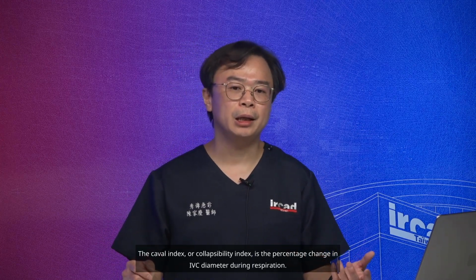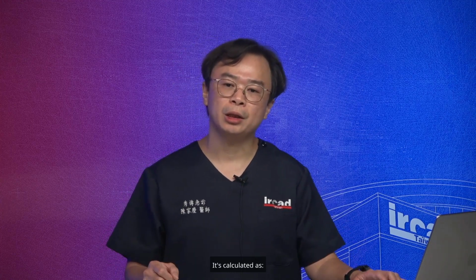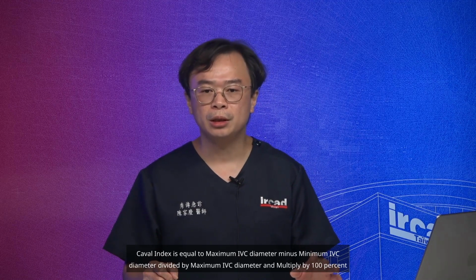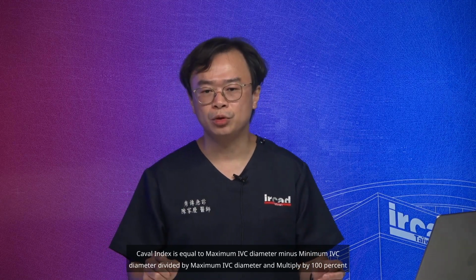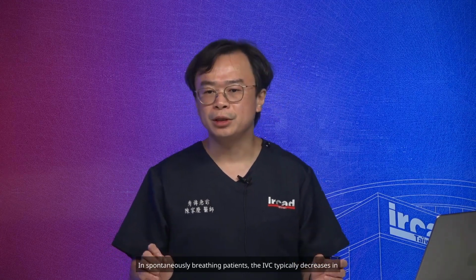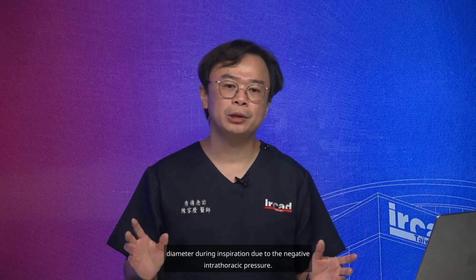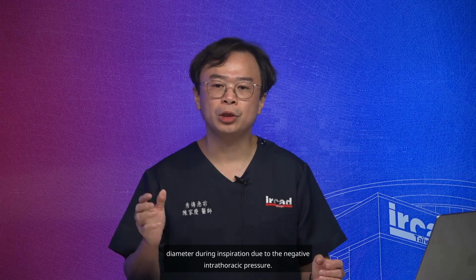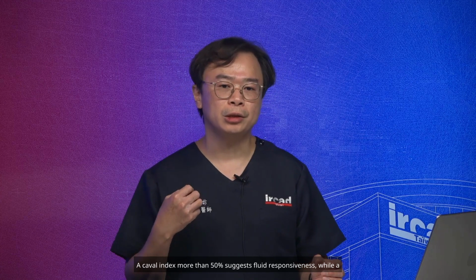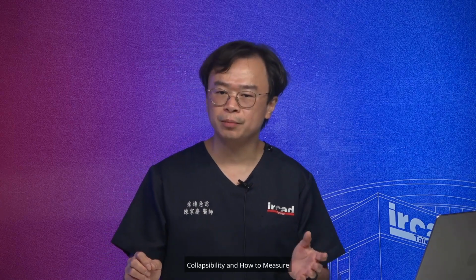The Cava index and its measurement. The Cava index, or collapsibility index, is the percentage change in IVC diameter during respiration. It's calculated as Cava index is equal to maximum IVC diameter minus minimum IVC diameter divided by maximum IVC diameter and multiplied by 100%. In spontaneously breathing patients, the IVC typically decreases in diameter during inspiration due to the negative intrathoracic pressure. A Caval index more than 50% suggests fluid responsiveness, while a Caval index of less than 50% suggests the patient may not respond to additional fluid.